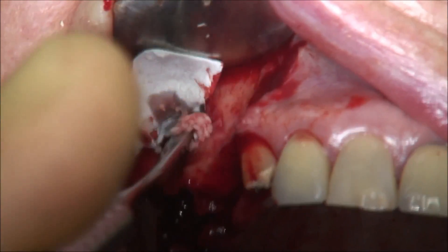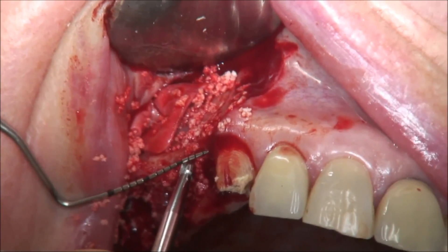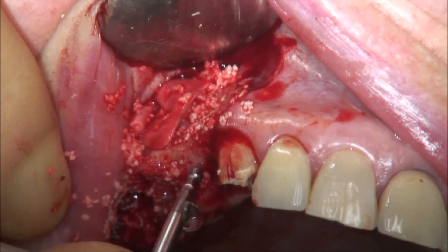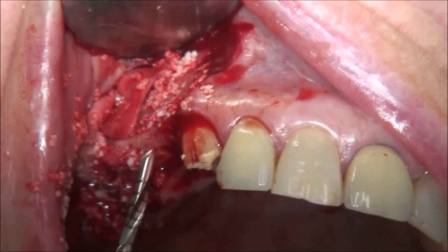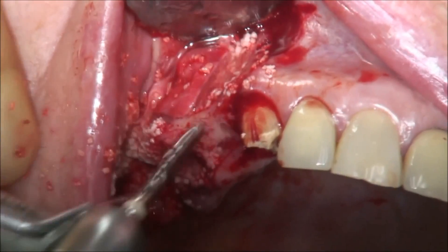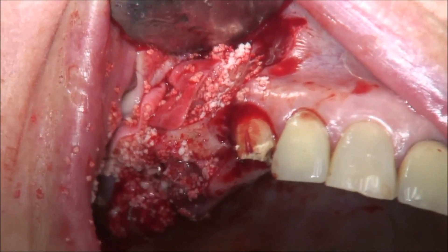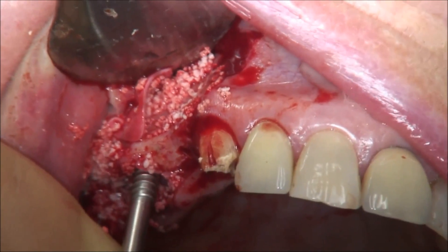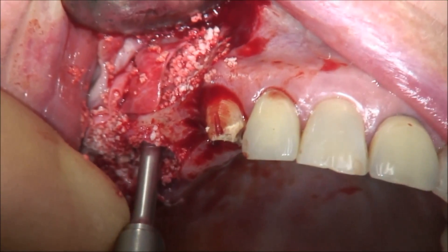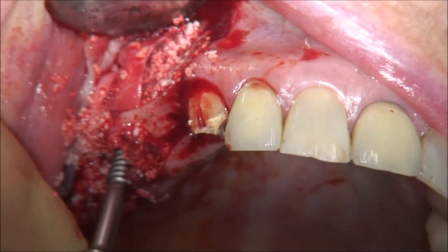The next step will be filling this huge sinus with 2 grams of augmentation material. The first drill will be 5 mm from the distal part of the canine, and the next one 8 mm to the distal. We use the first drill, then the pilot drill, 2 mm diameter — three positions, 2 mm pilot drilling each. Because the bone density is D3, we are using screw osteotomes with a convex tip. They go into the bone, condense the bone laterally, and give excellent primary stability for the 6 BHI implants we are going to insert.